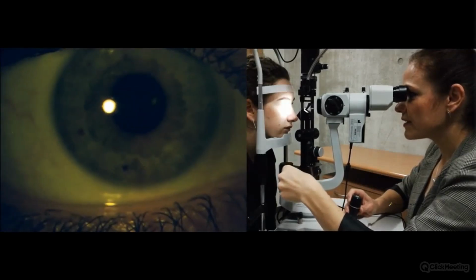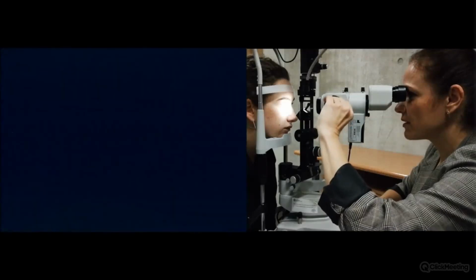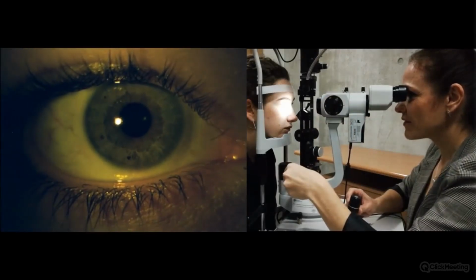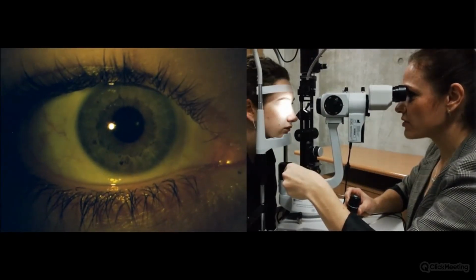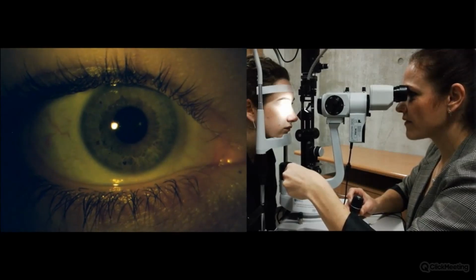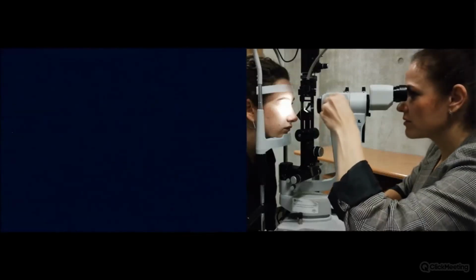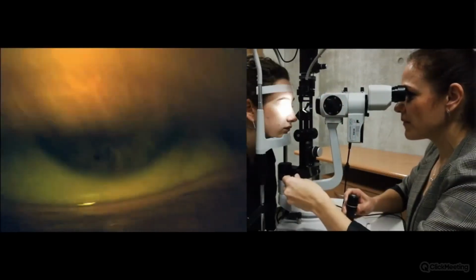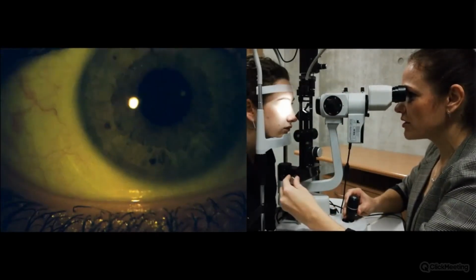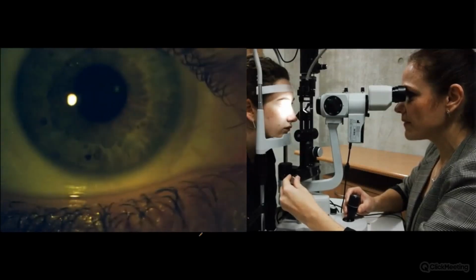Here is a contact lens. It's not so easy. I wanted to reduce the magnification, but it's my mistake. Just now there is 6-times magnification on the slit lamp, and in diffuse light we look at the centration of the contact lens. It covers all the cornea. Then we ask the patient to blink in primary position and look at how much these movements are.